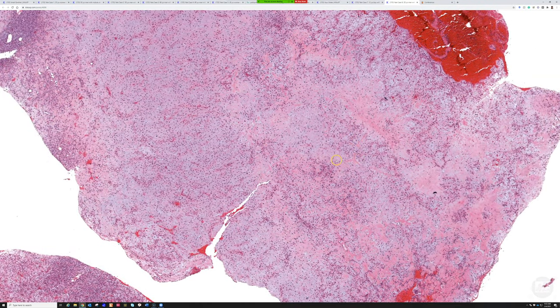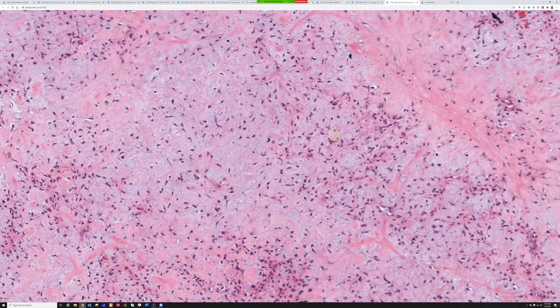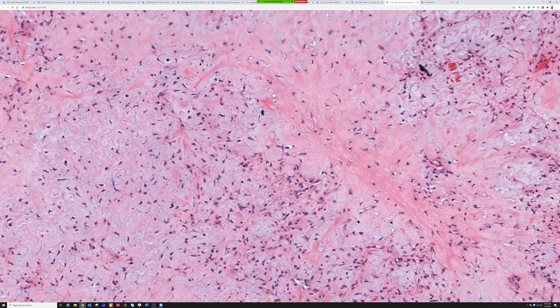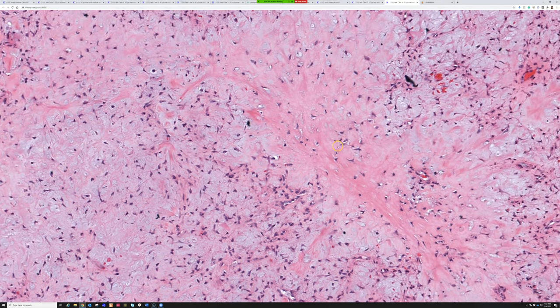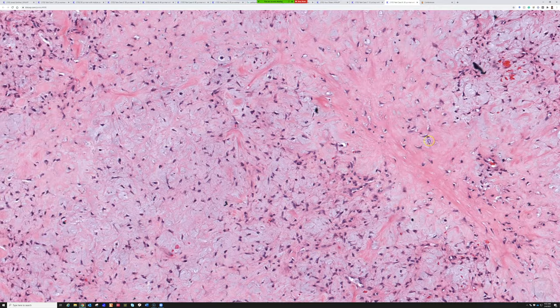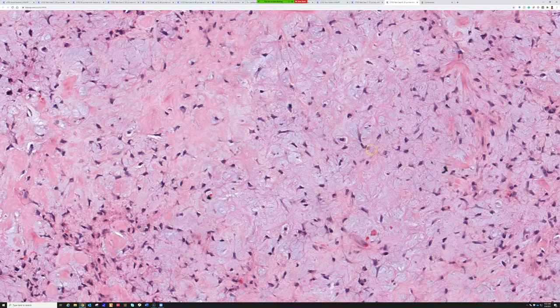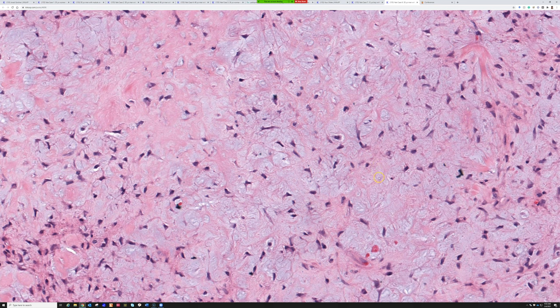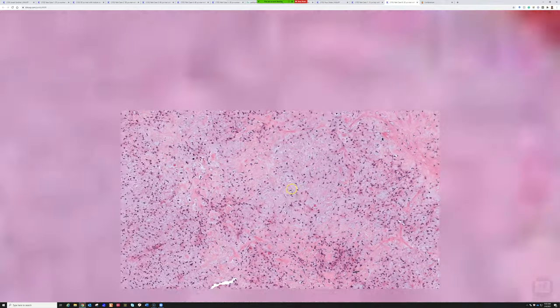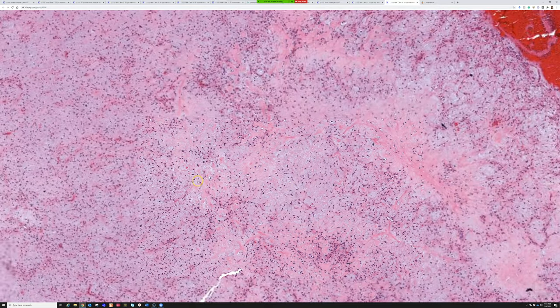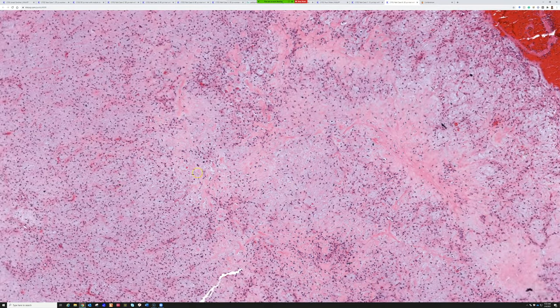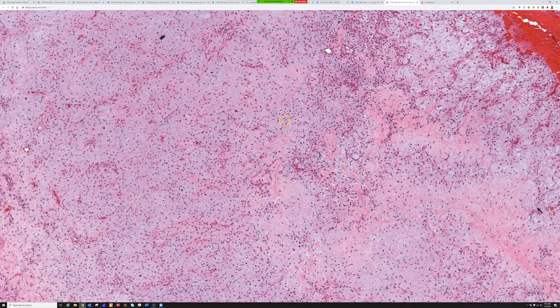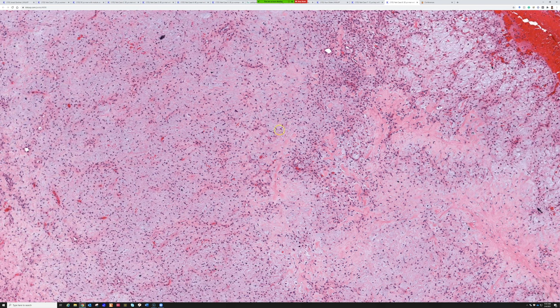On higher power, the pink areas are the fibrosis and the pale to light blue are the chondral myxoid. The cells themselves are bland, spindle to stellate, and I didn't appreciate any mitosis, atypia, or necrosis.